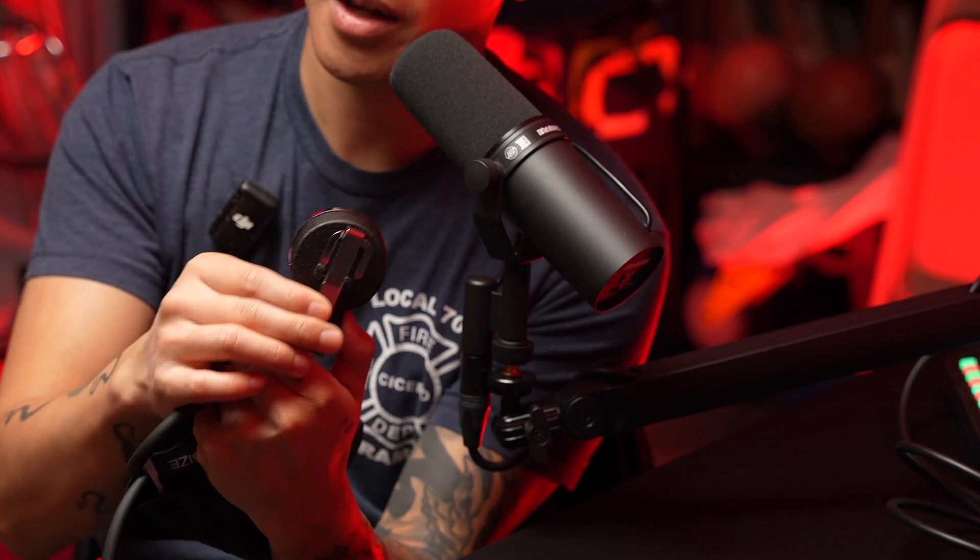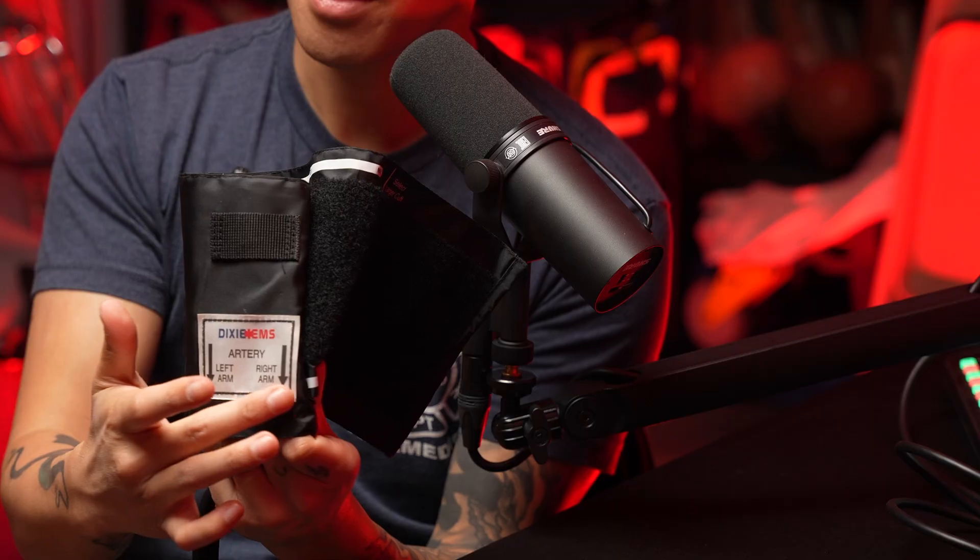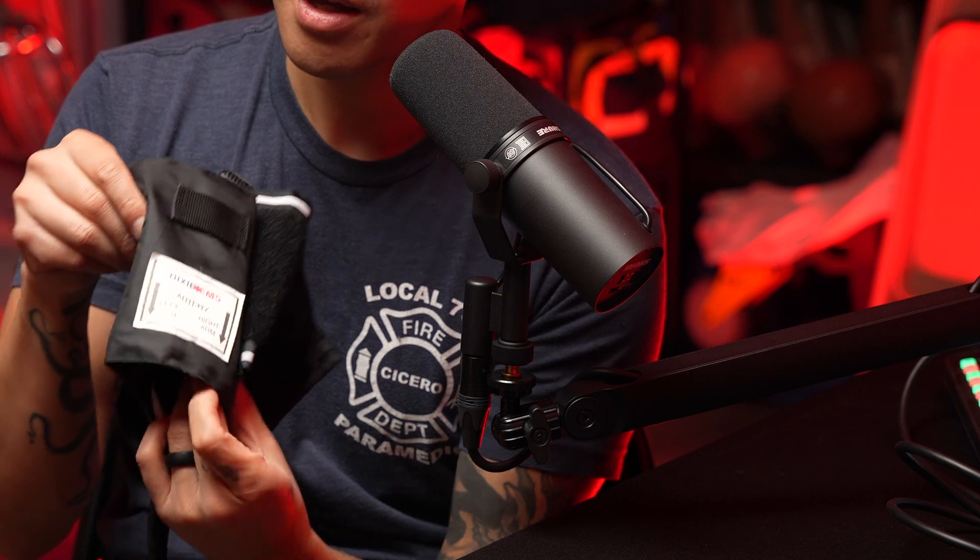So Russ is going to take my blood pressure — Russ is going to set herself up for success. With the sphygmomanometer, there is a clip on the backside that you can apply to your shirt or to the blood pressure cuff as well. When you do apply the cuff, you want to ensure that these arrows are right on the center of your arm, because these arrows indicate the center of the bladder of the blood pressure cuff. So Russ, take it away.